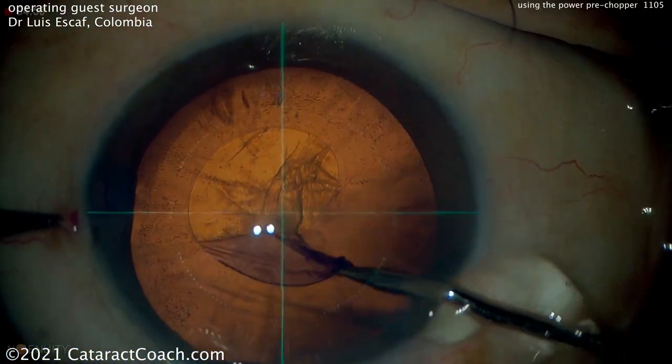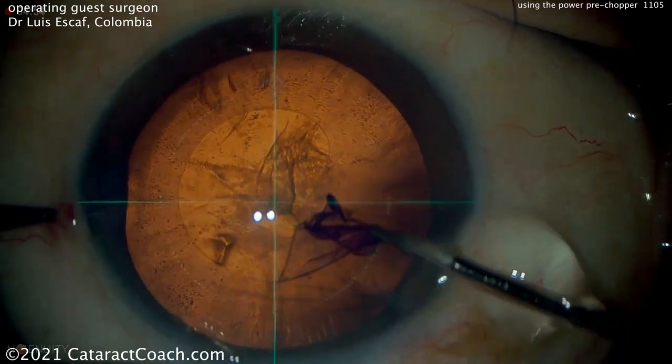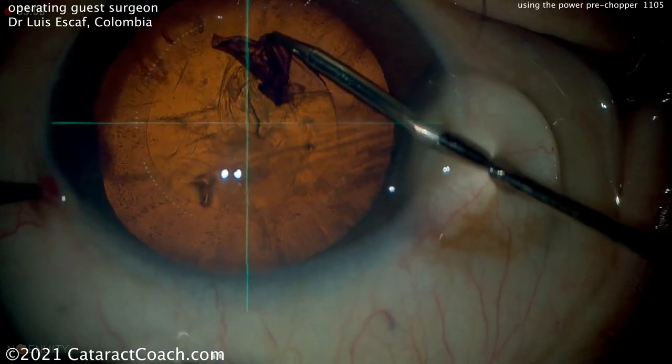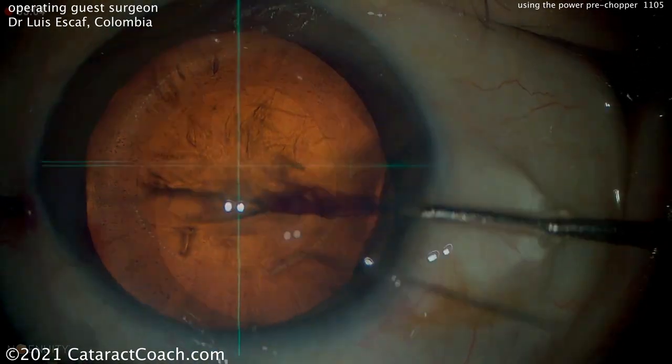Now switching over to the forceps, he can create a nice round capsulorhexis. And you can see a guide can be given by this heads-up display, and also the center of the eye is known at all times. So this is a useful device here, and that looks like a beautiful capsulorhexis.